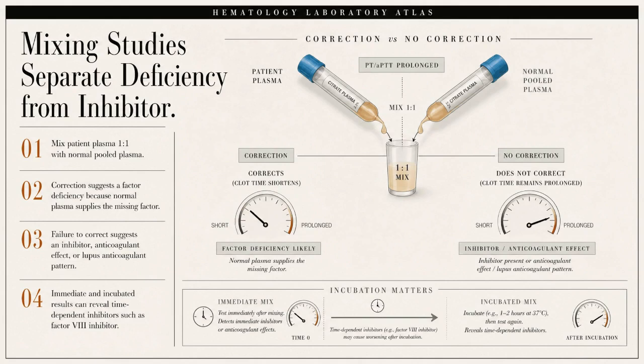Some inhibitors are time-dependent, so we might do both immediate and incubated mixes. This is a functional test, an experiment in the lab, that helps us narrow down the cause of an abnormal screening result. This leads us directly to how we pinpoint the exact factor involved.